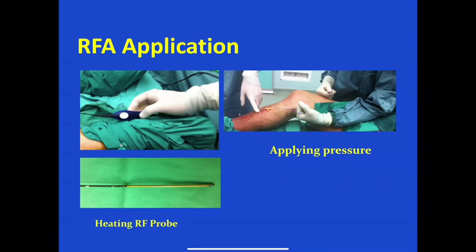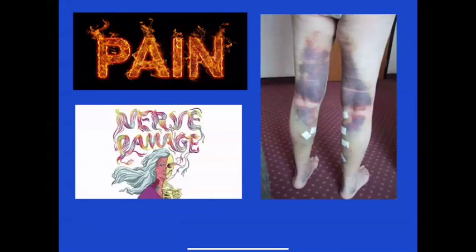And therefore you have to get the head down for the bigger veins to collapse that vein down, or good tumescence to get that vein strung onto the catheter, and obviously with external compression. What I've noticed, even with RFA, is that however good you give the tumescence, and I'm very particular, especially during training as well, to give that tumescence in the correct place and then give it properly, you do get a lot of bruising.